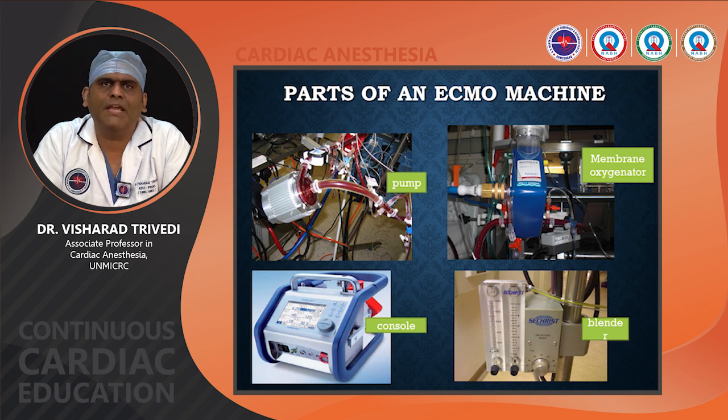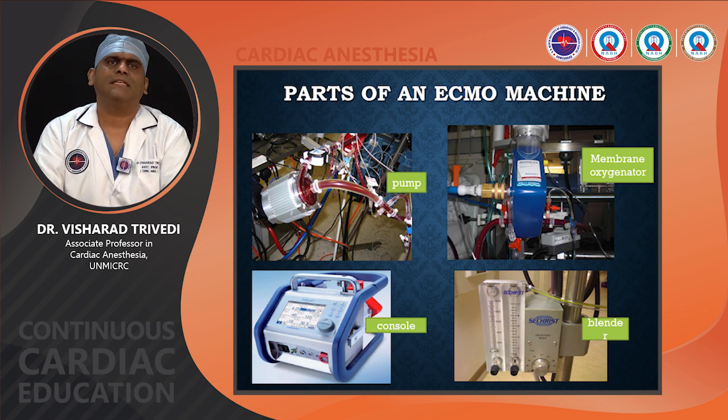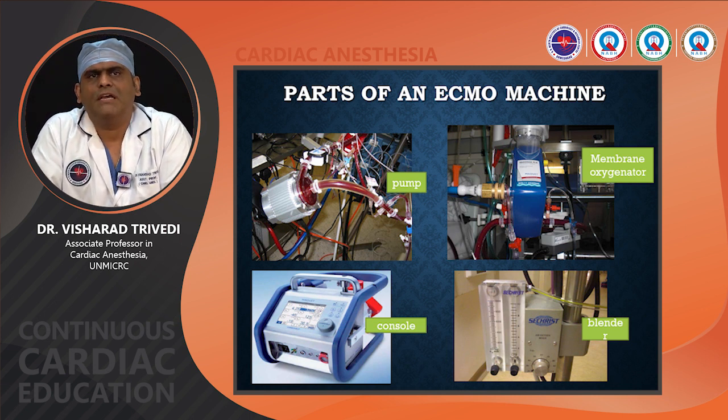So these are the parts of the ECMO machine, which I think you must have become acquainted with in the previous lecture. There are mainly 4 parts for VV ECMO. First is a pump, second is a console, third is a membrane oxygenator, and the fourth is a blender.